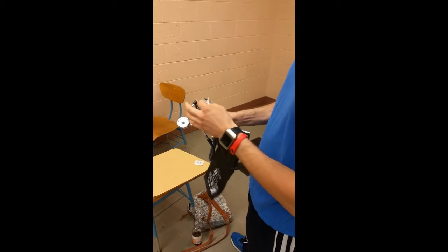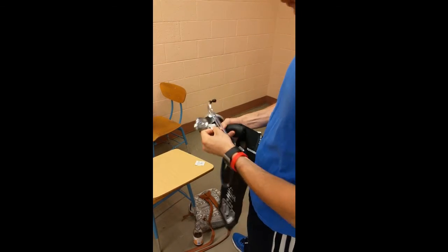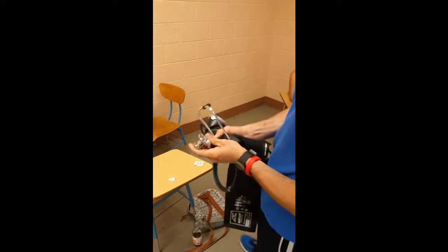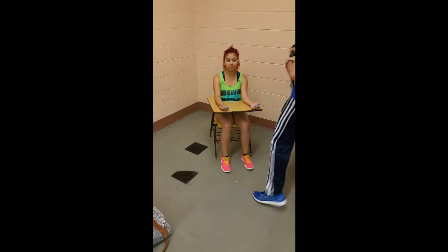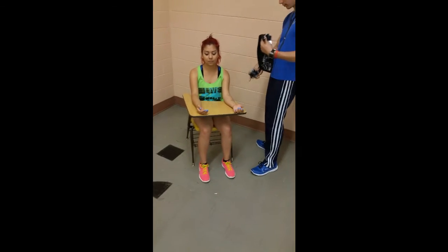Clean the earpieces before inserting them into the ear canal and make sure that the earpieces are pointing forward. Once inserted, gently tap the large circle of the chest piece and ensure that the tapping is heard. Once you've completed all those steps, you are ready to take your patient's blood pressure.